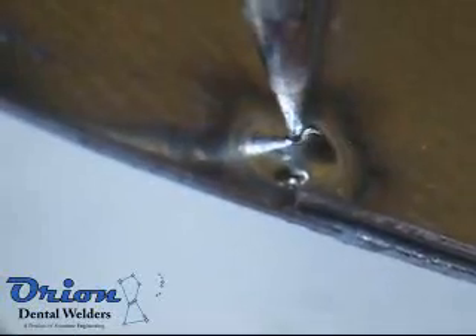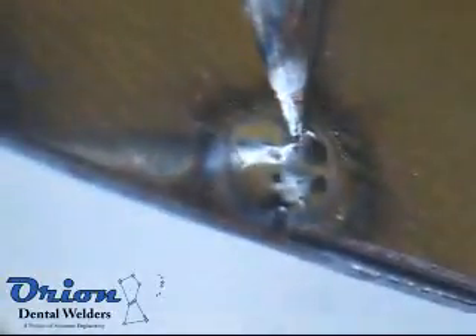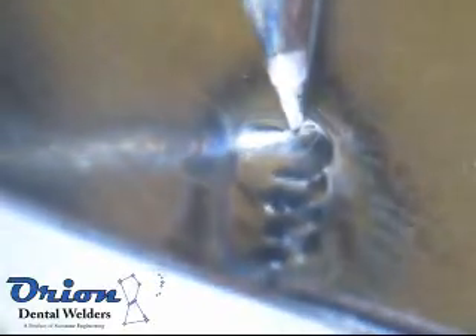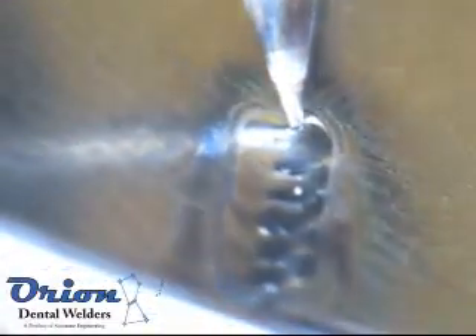The Orion Stereo Microscope is a valuable tool when welding intricate and even large parts. The optical shutter system provides unobstructed optical clarity and is computer controlled to ensure complete eye protection.